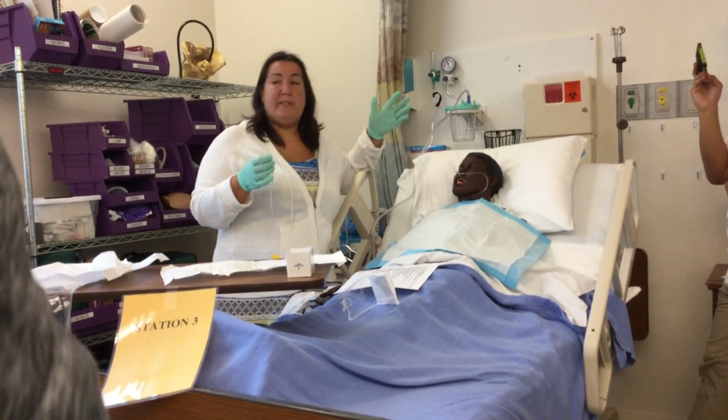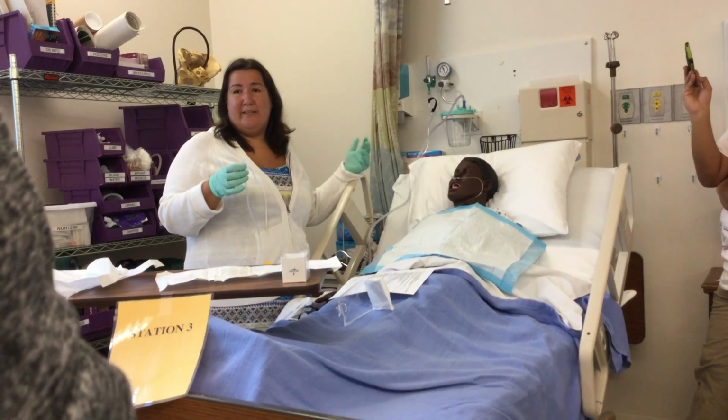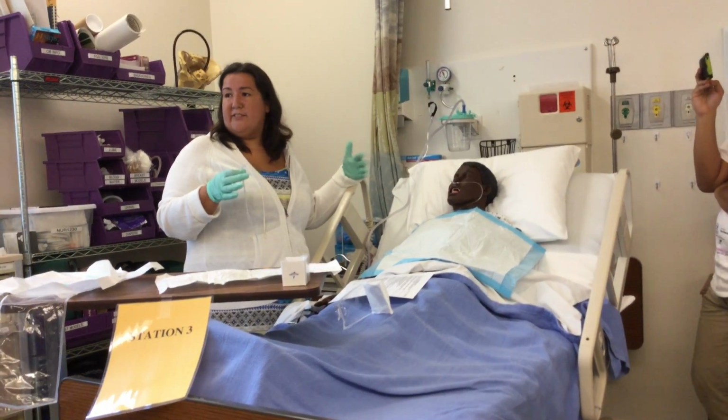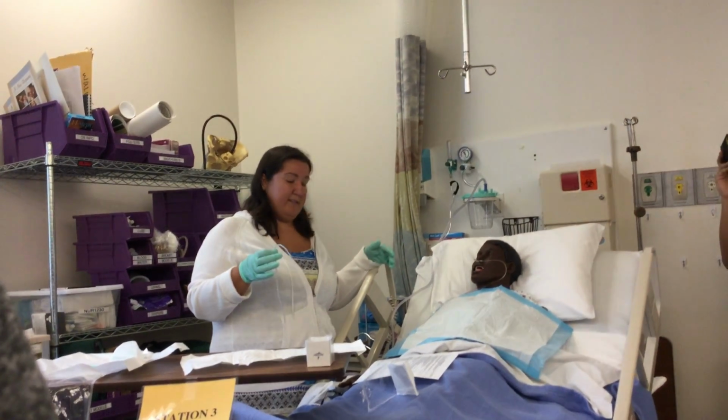Now, if they're still kind of stuffy, you can do it again. You can do it a third time. You really don't want to keep going because then you can damage their mucosa and stuff. So you don't want to over suction. You can go in one more time if you have to, if they still sound congested.